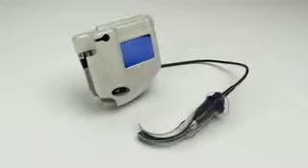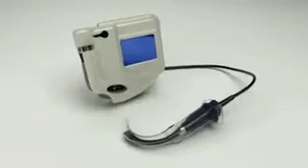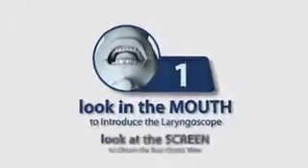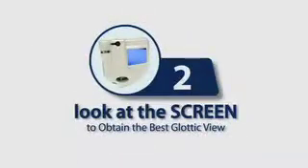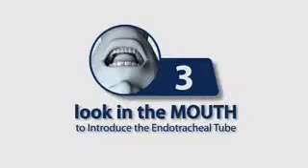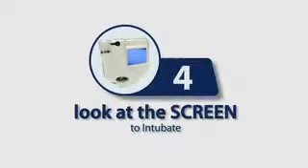To review, the 4 steps to successful Glidescope videolaryngoscopy are: in the mouth, to introduce the laryngoscope; at the screen, to obtain the best glottic view; in the mouth, to introduce the endotracheal tube; and at the screen, to intubate.